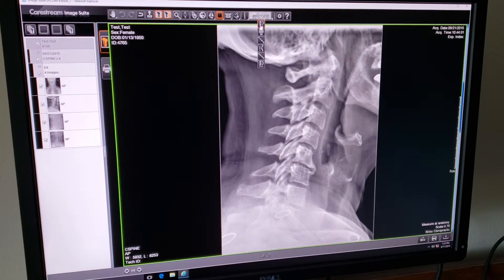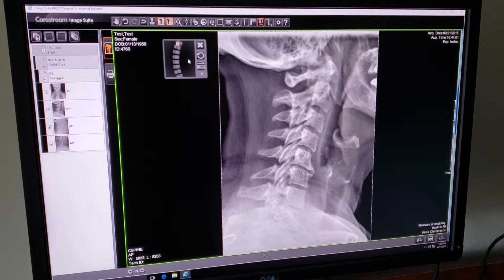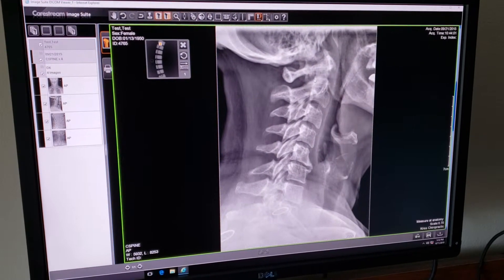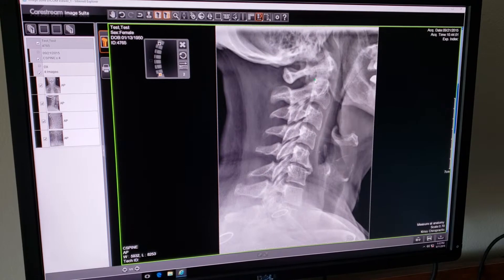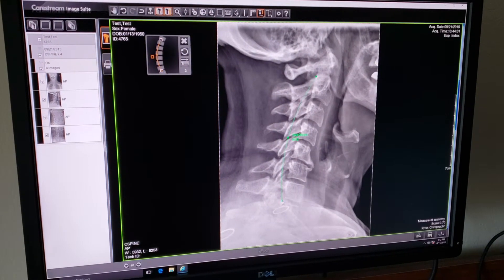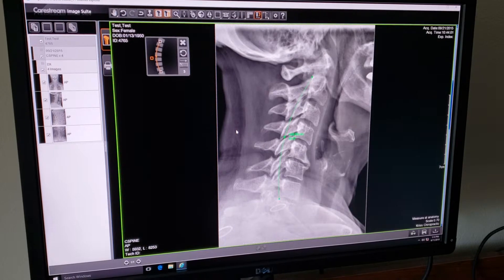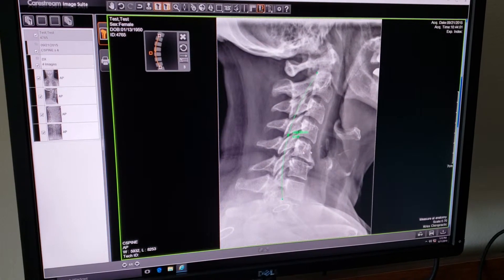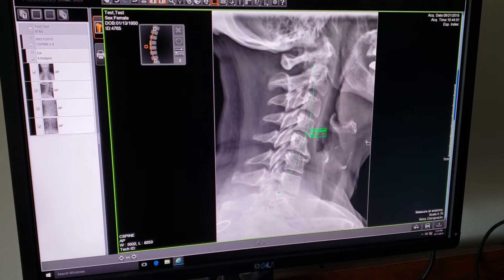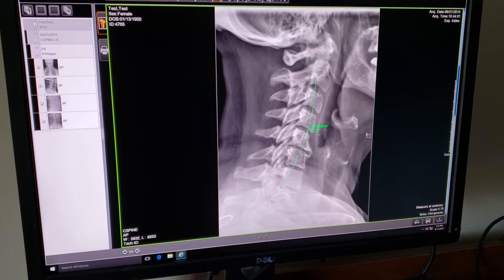The first tool in this line is the cervical curve. If we click on the cervical curve, it's going to give us a demonstration on how to use it. Click a point posterior superior of C2, then posterior superior of T1, and then click whichever way the patient is facing — left side of the screen if facing left, right side if facing right. There is a normal cervical curve for that patient. Click one more time and it stops the tool.